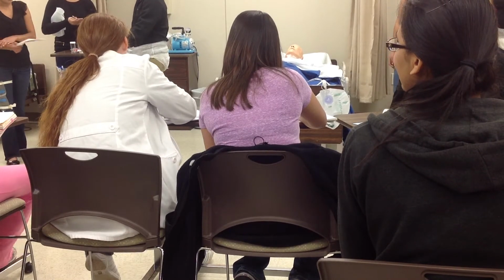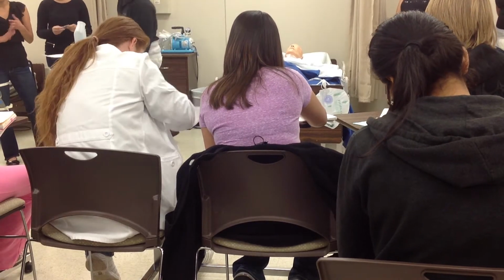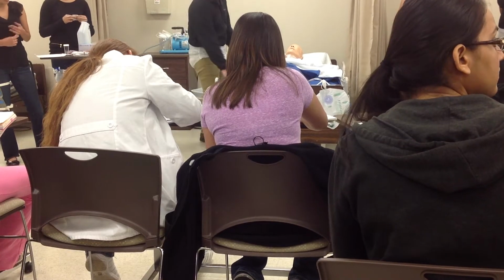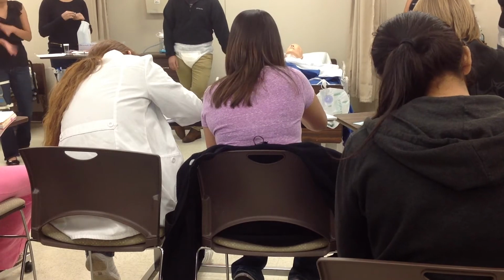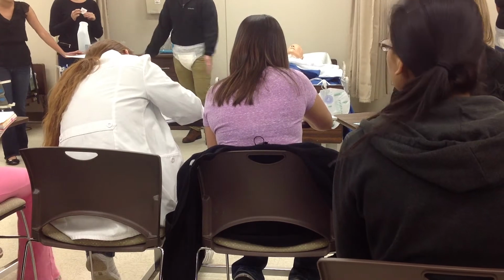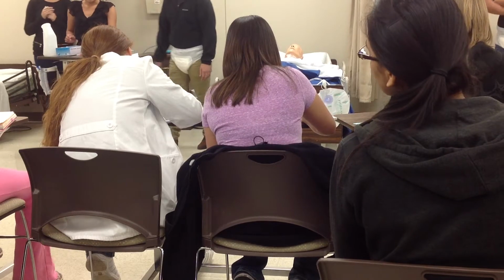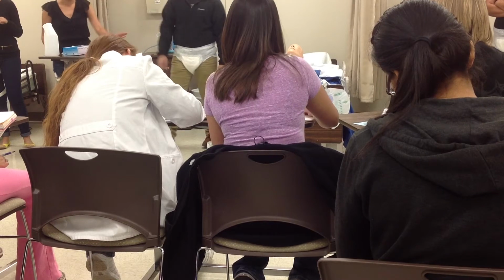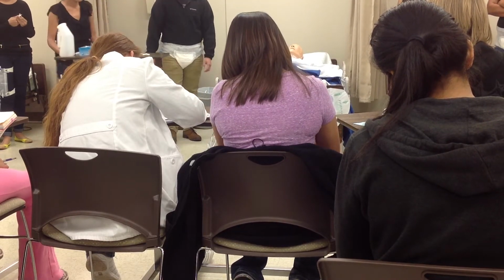Okay, some standard procedures for anything is we want to check your doctor's orders and to see what specimen, how much, stuff like that. We want to check your institution policies and procedures, identify your patient and for allergies, and do medical hand wash and gloves when appropriate. First thing we're going to teach y'all is how to do a sterile specimen from a catheter. What you're going to need is a 10 ml syringe, a biohazard bag, a rubber band, gloves, alcohol swabs, and a specimen container.